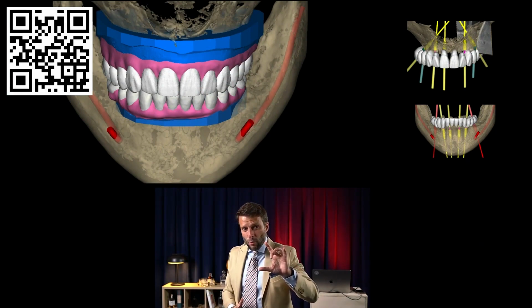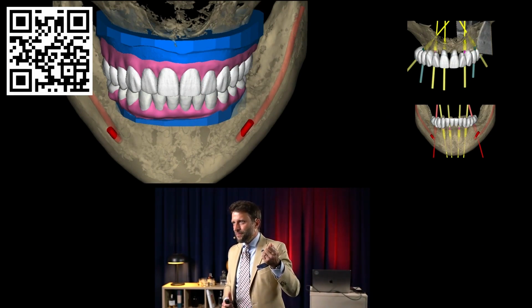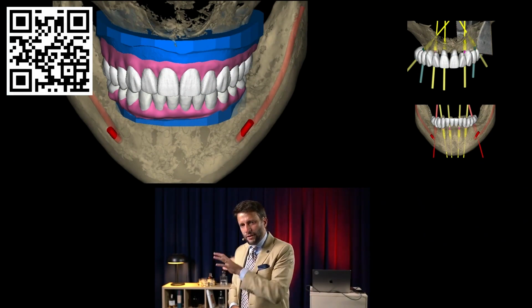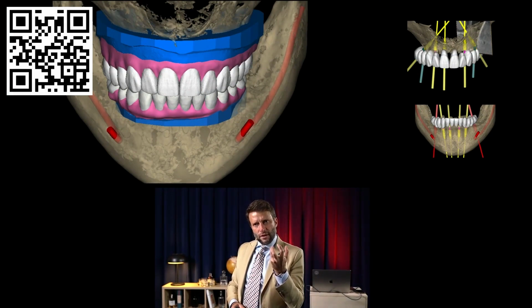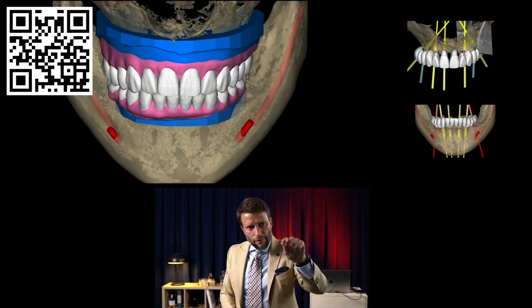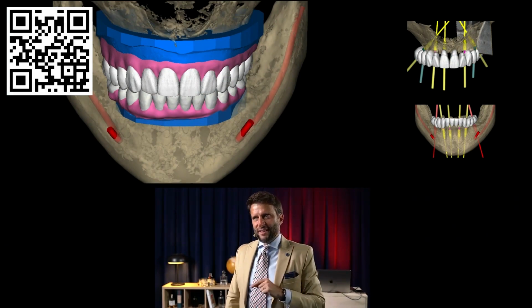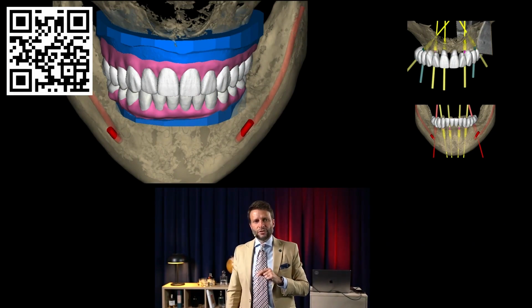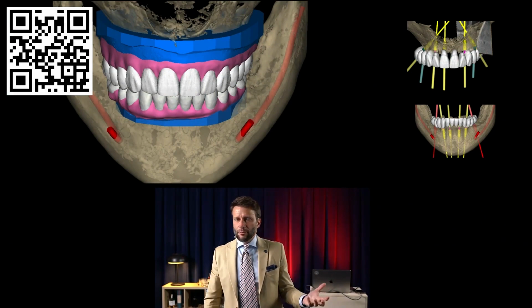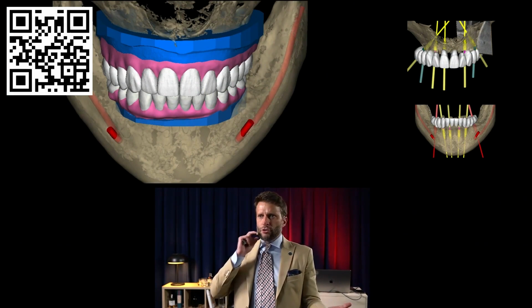But what if you can explain this to your patient to make it even more powerful? What if you can make a summary of the last 5 minutes that I just explained to you? You change the words for patients and you explain in 30 seconds the power of this technology and how lucky the patient is for going to a dentist that uses that technology. Can you create a story out of this? Can you make the patient say, wow, that's cool? Can you make the patient even more loyal to you?